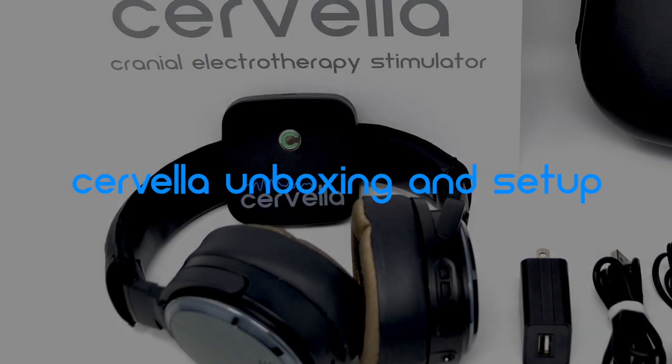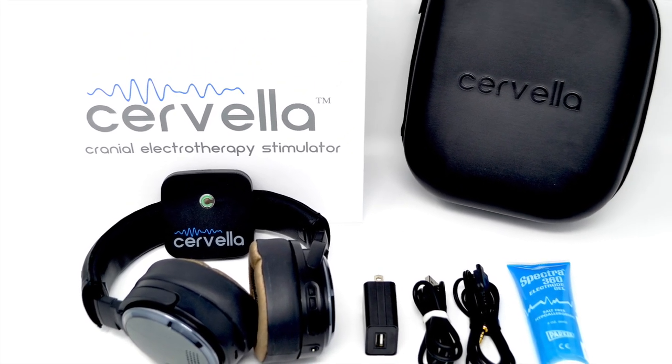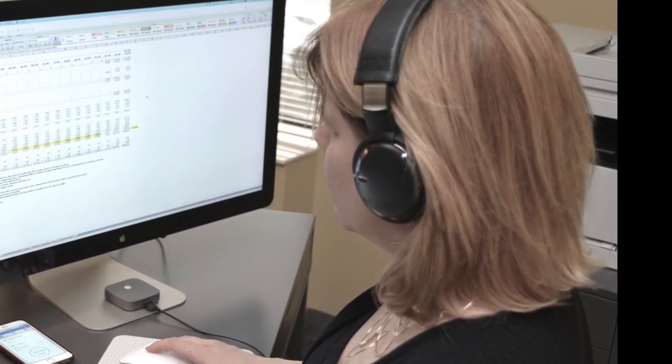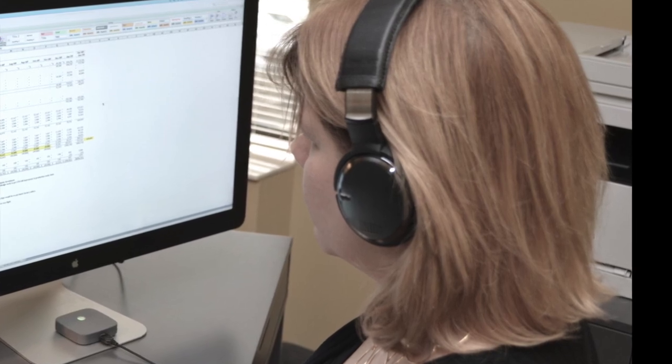Cervella is the world's first cranial electrotherapy stimulator with proprietary conductive treatment electrodes that have been seamlessly integrated into an audio headset, allowing patients to receive treatment during study, work, or play.